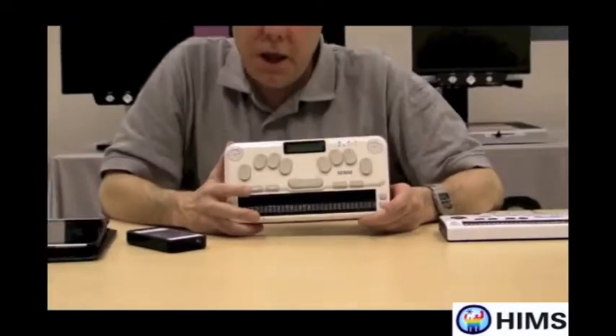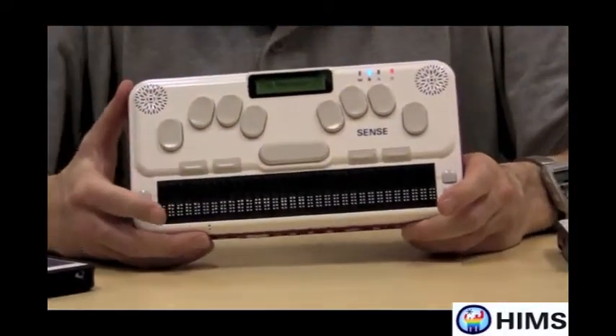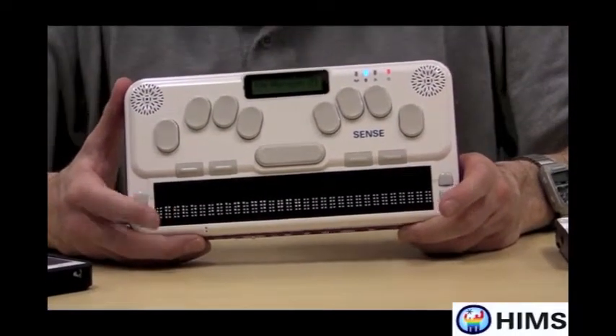Hello, my name is Scott Hegley, and I'm with HIMS Inc., a company located in Austin, Texas. Today we're going to be talking about our new BrailleSense U2.